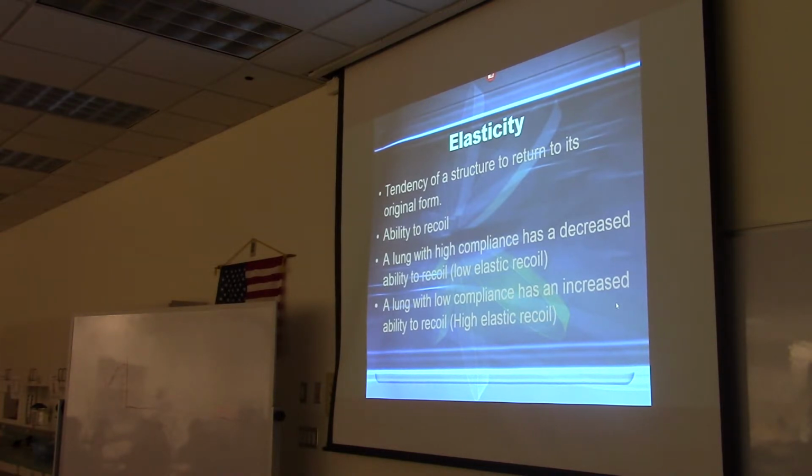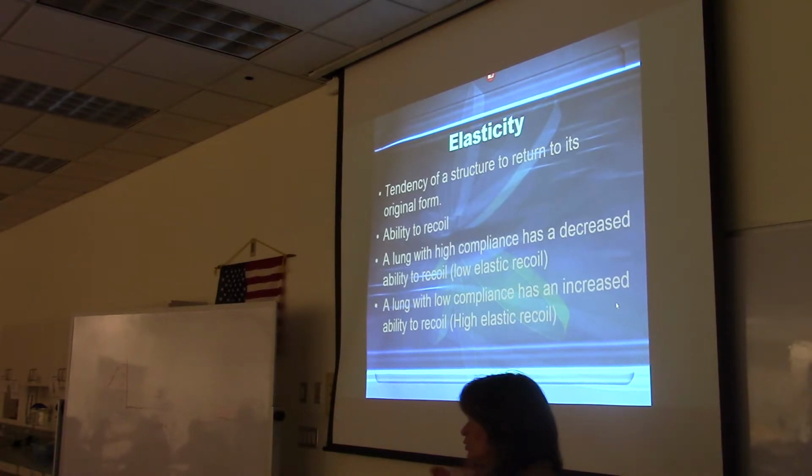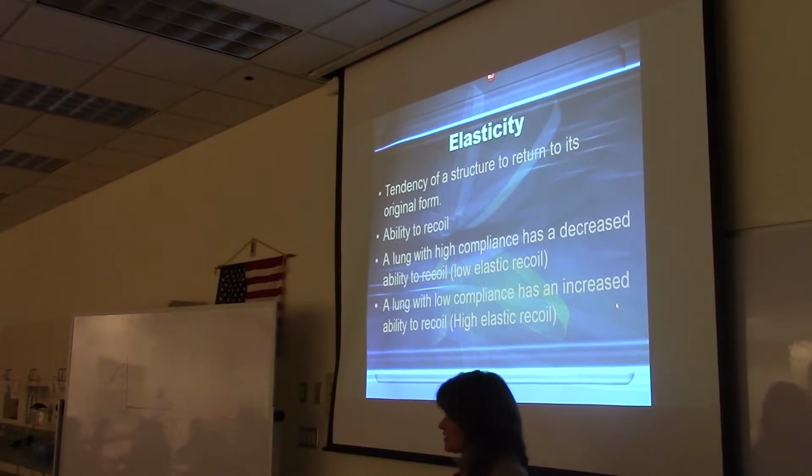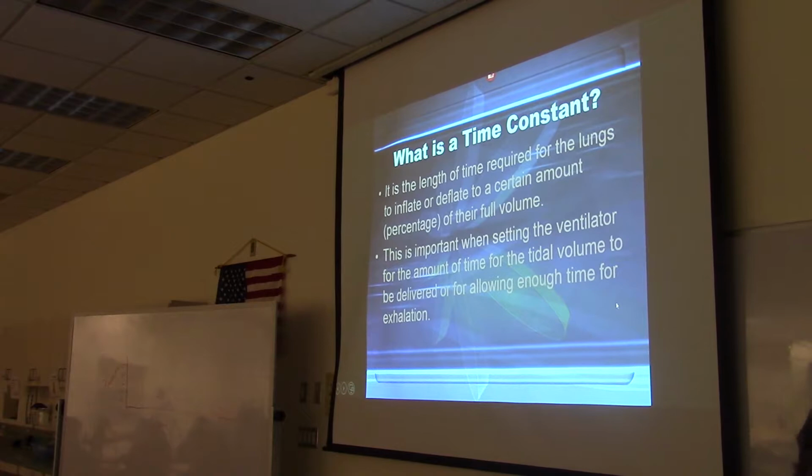This is going to tie into when we're putting settings on the ventilator, and you put air into the lungs. How long do you have to leave for the air to come back out again? So this is kind of a lead into that. What is a time constant?